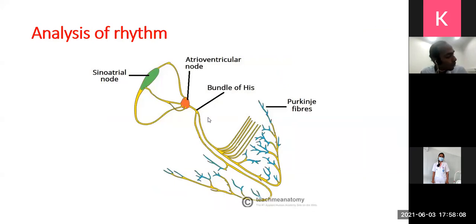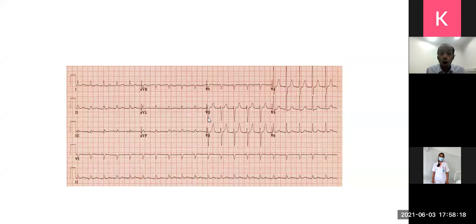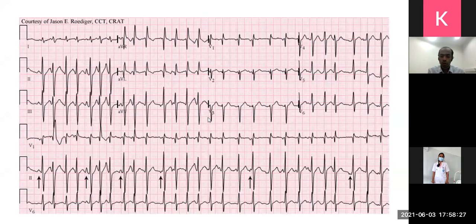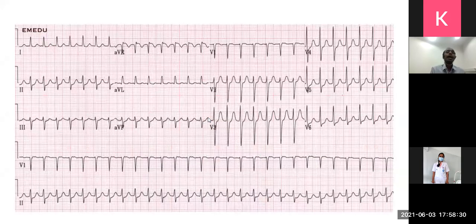All right. Now, then we went through various ECG patterns. I told you that if it's sinus rhythm, you will get a normal P, normal QRS complex. If it is an atrial rhythm, you will get abnormal P waves, and there are various types of abnormal P waves. Atrial fibrillation, flutter, unifocal or multifocal atrial tachycardia. And then those are the atrial rhythms. Absent P, QRS only would be a nodal rhythm. I told you that there can be a retrograde P from the AV node back upwards, but that is very difficult to spot. So essentially for a medical student, a nodal rhythm is a QRS without a P.